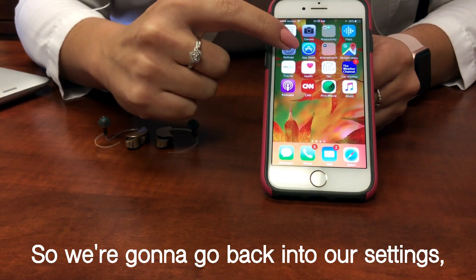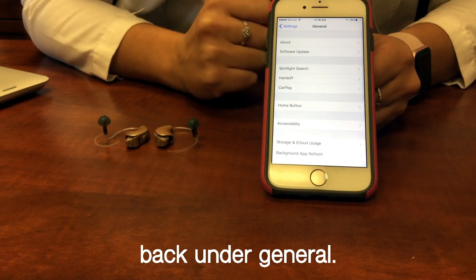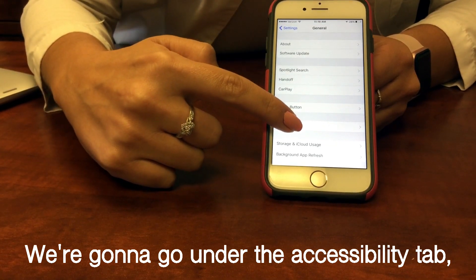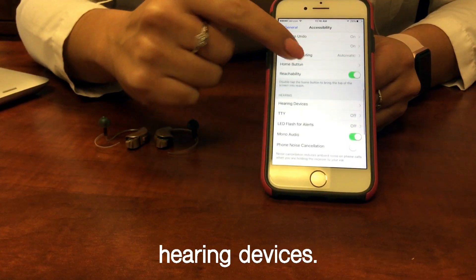We're going to go back into our settings and this time scroll down back under General. We're going to go under the Accessibility tab and then scroll until we see Hearing Devices.